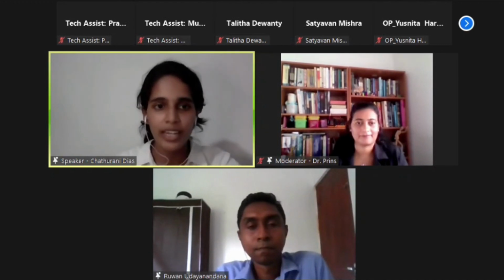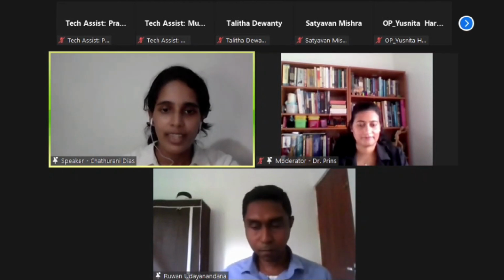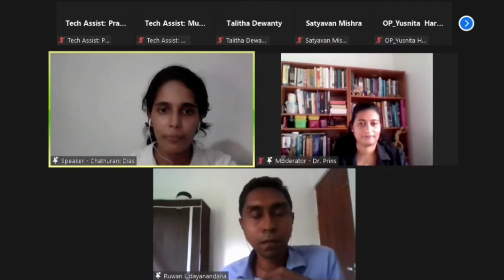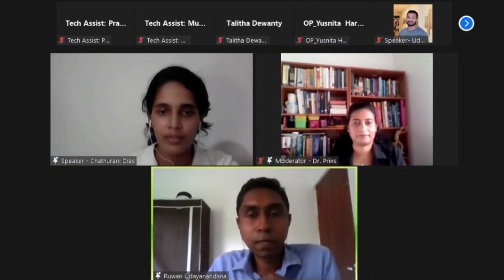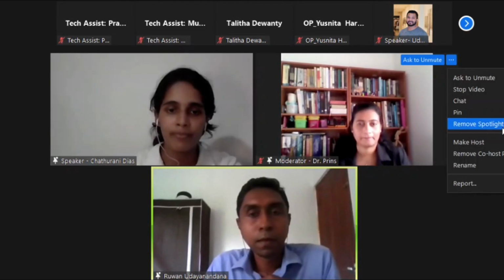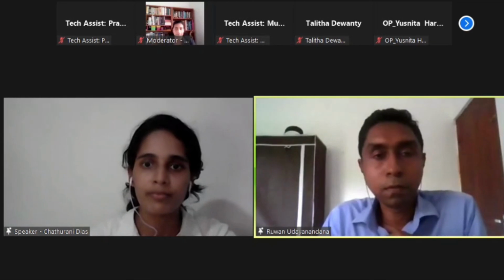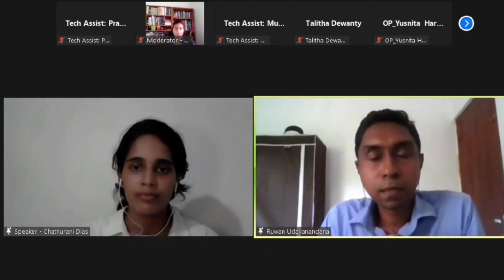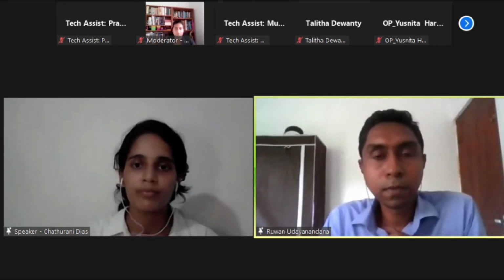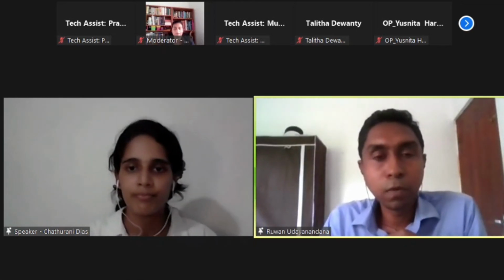Ruan, would you like to add something to that? Yeah, I mostly talk about material. When you look at the solution section, like insoles and this orthotic side, we have to look at better materials, and at what materials will minimize or distribute pressure more effectively.